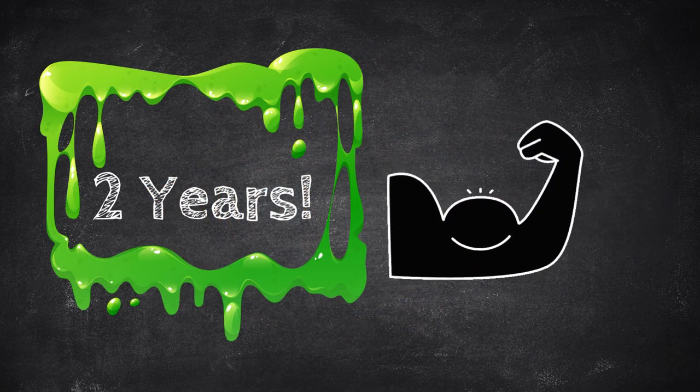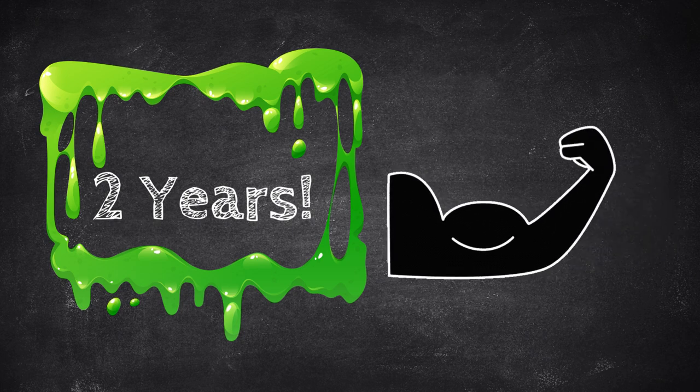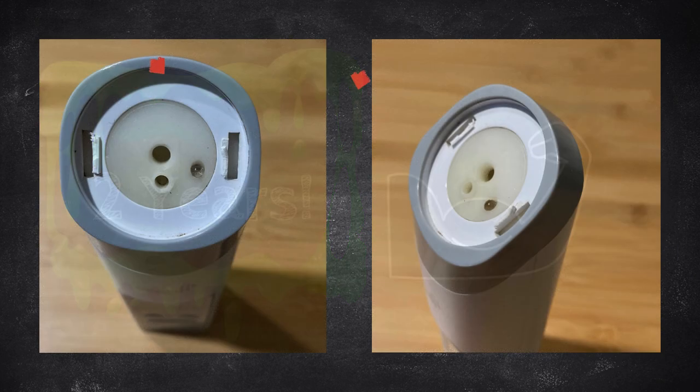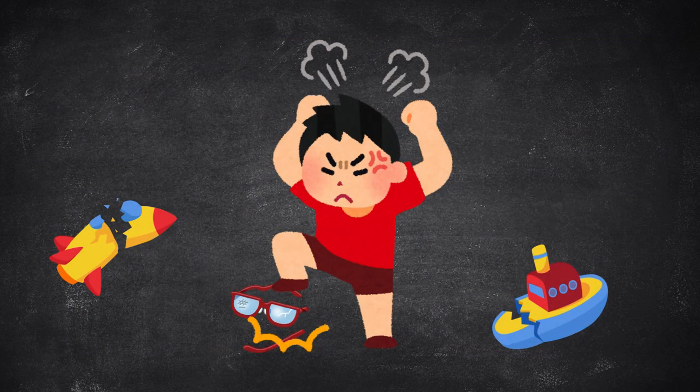We've been using this snot sucker since day one, and it's still kicking at the two-year mark — it is definitely a trooper. Only recently have the two locking notches broke, but I attribute this to the kiddo parading around the house with it when he snagged it from the table. It still works.